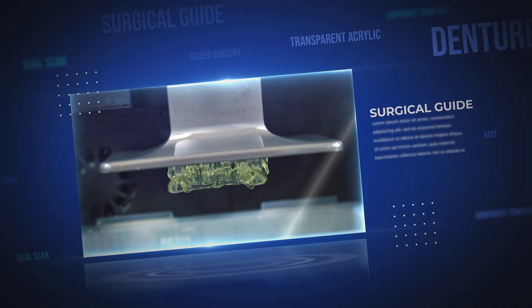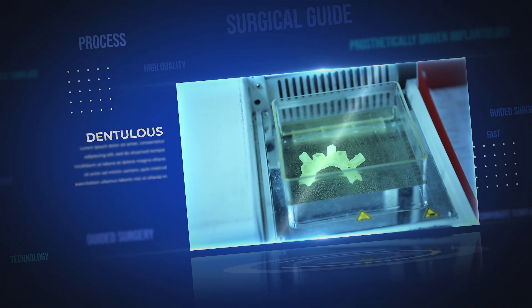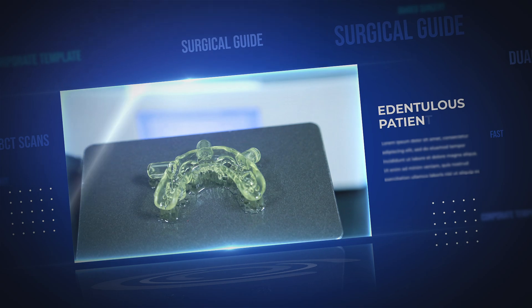Dencare Surgical Guide is fabricated using 3D printing technology, making a biocompatible surgical guide with high precision and custom fit.